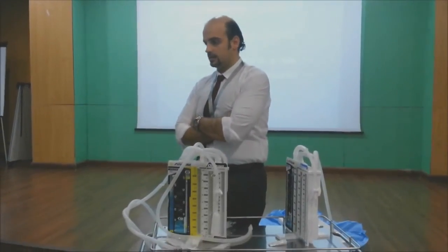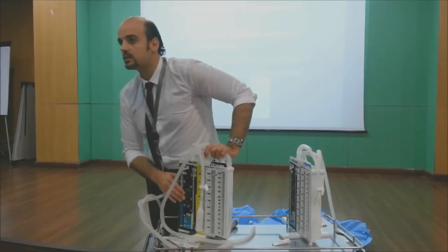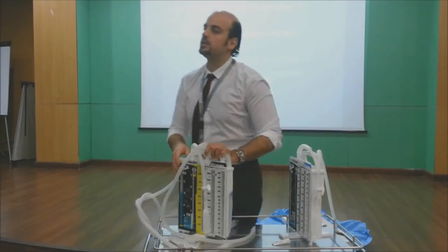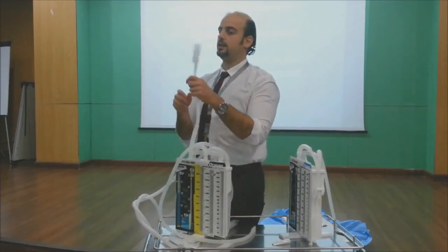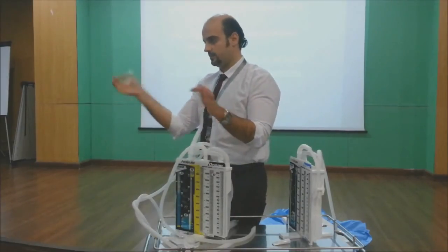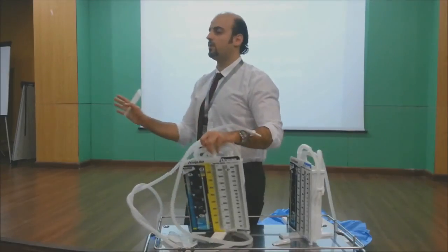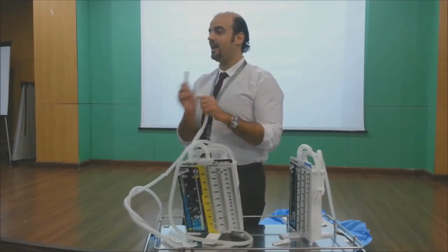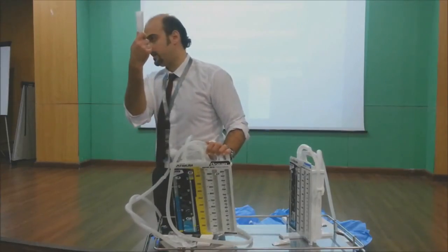Okay, but are we talking about underwater or the suction port? Suction port? Yes, it will affect, because you keep it on suction. If there is no suction and this is empty, no problem. But if there is suction and this is empty, it will suck air into the patient.